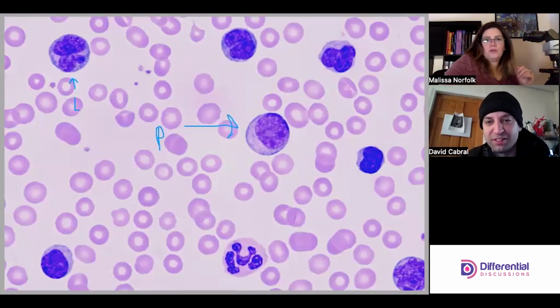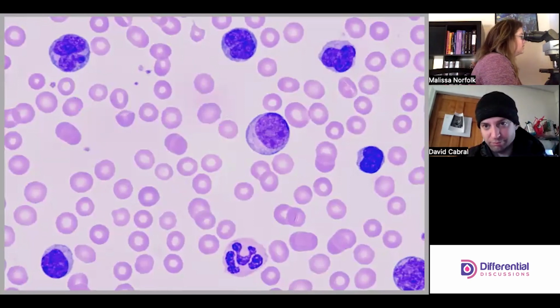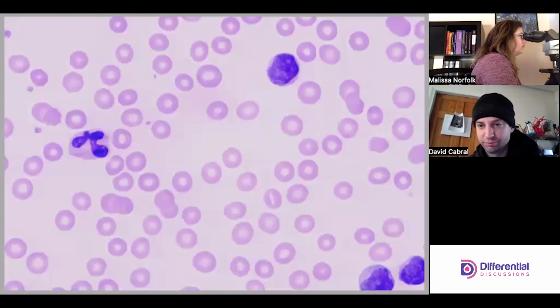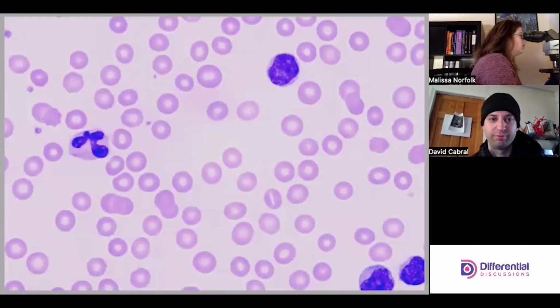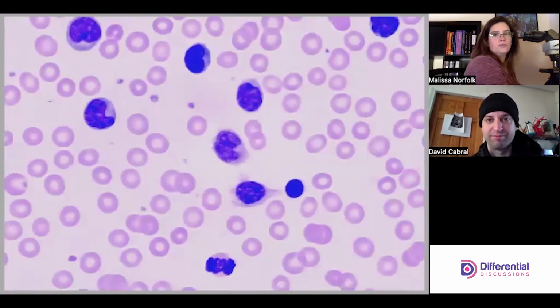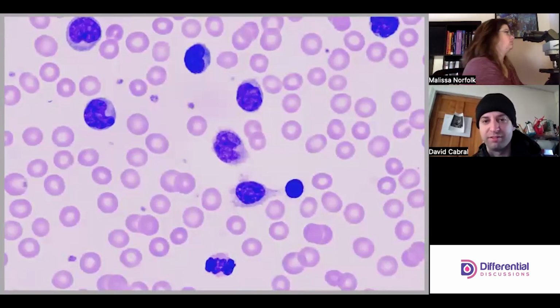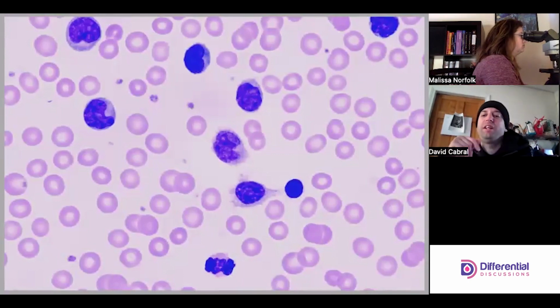Agreed. And then let's just move it so I can clear. I just want to see some more of these nice looking lymphocytes. That's a neutrophil, not a lymph. Oh, here's a nice one. But all just a bunch of resting lymphocytes. But again, the key is there's no more smudge cells, really. Some of them look like they might want to be breaking.